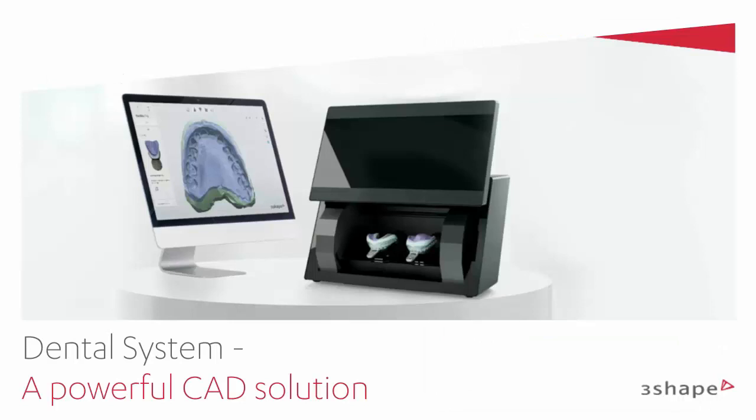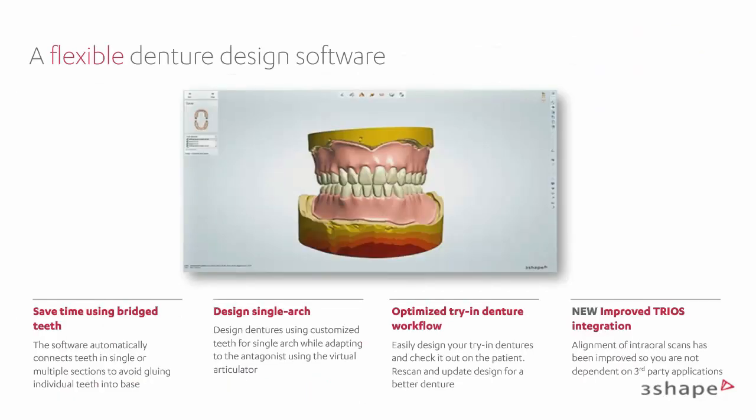So on the CAD side, Rahul, that's your part. Yeah, let's do this. I'm going to talk about the software and dental system. We've really been investing a lot in the CAD software. As Rune said, he's been very interested in digital dentures, and we've been researching for almost 5 years. We've had the software out for more than 3 years, and it's been a journey, but I think right now the software is in a really good place, with quite a lot of good workflows.